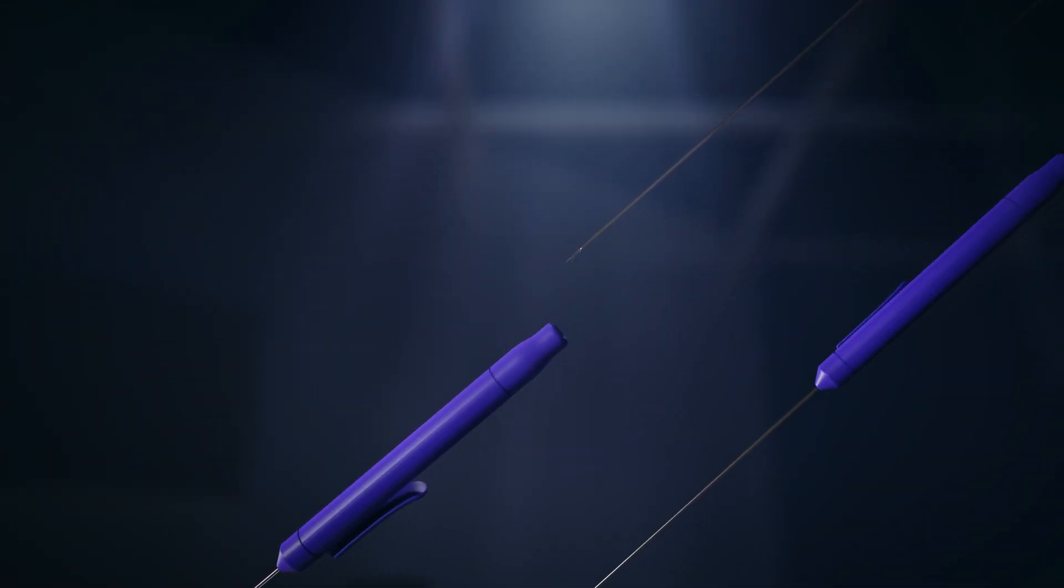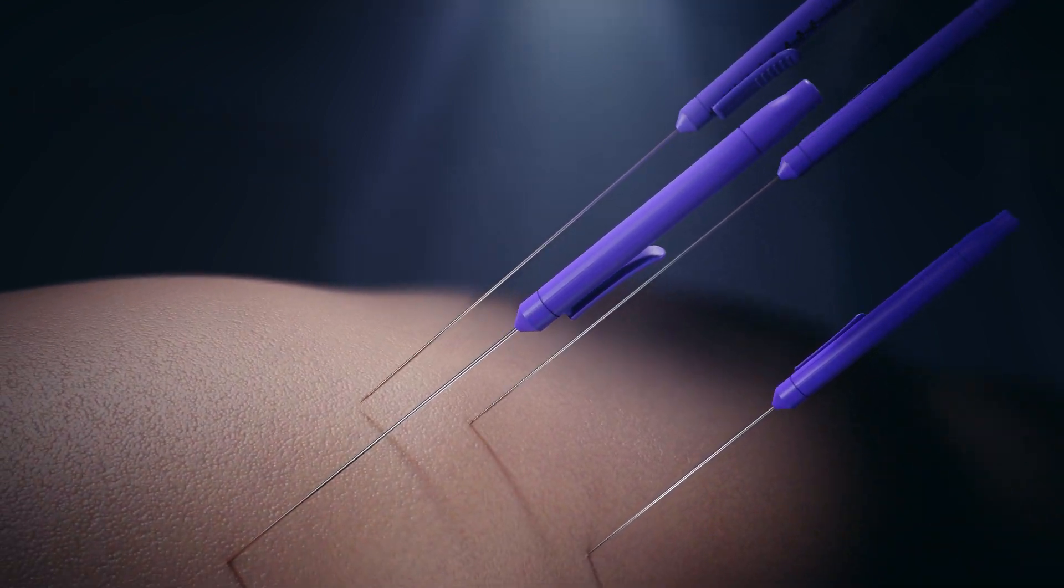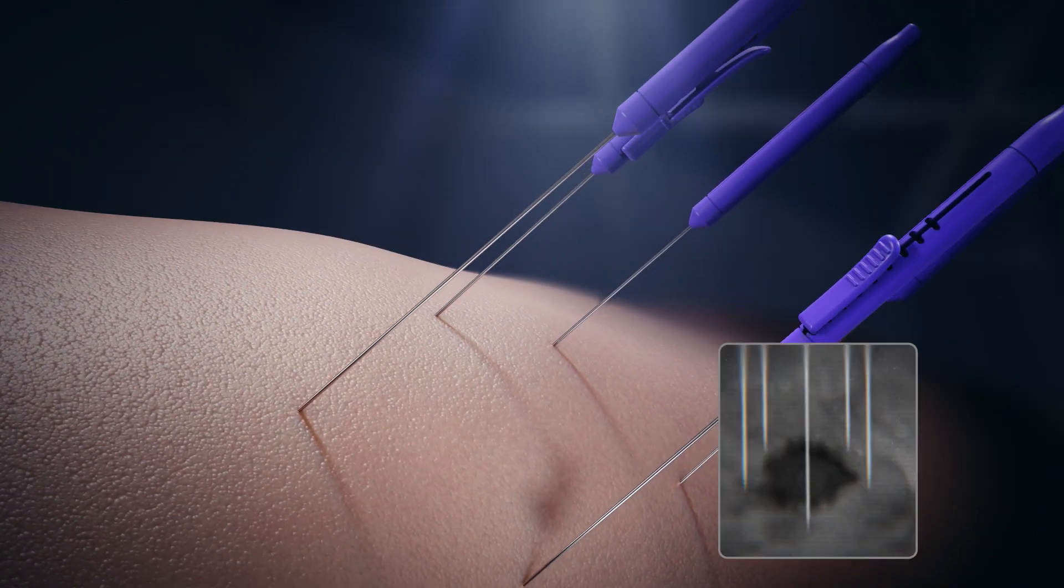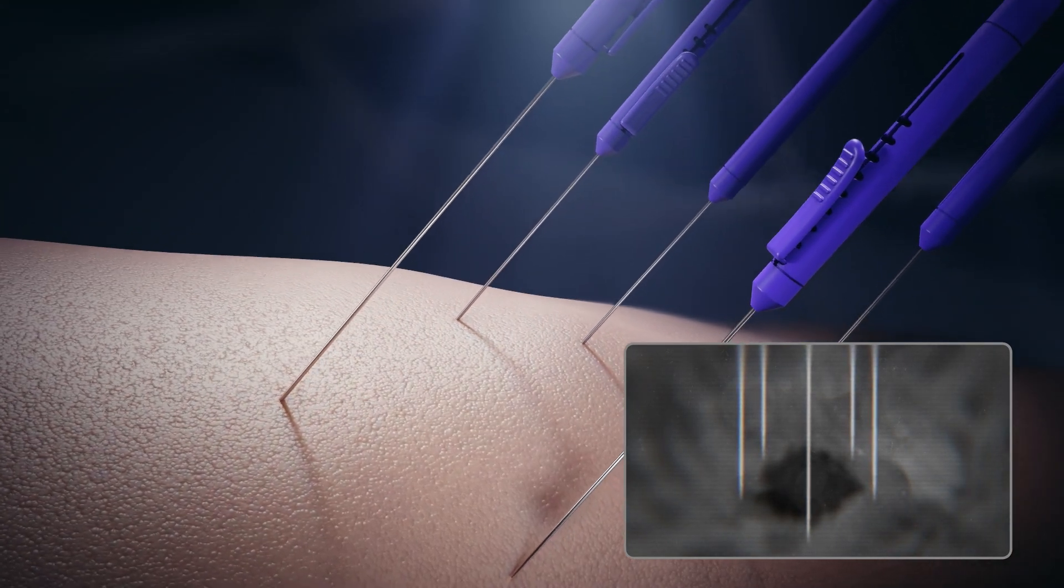Two or more minimally invasive needle electrodes are positioned in or around the diseased tissue using real-time ultrasound guidance or CT.